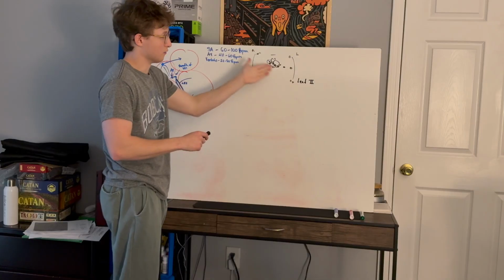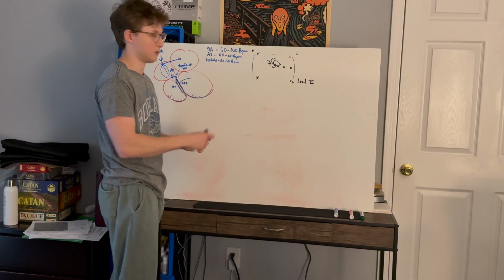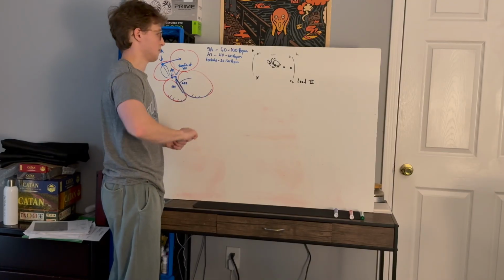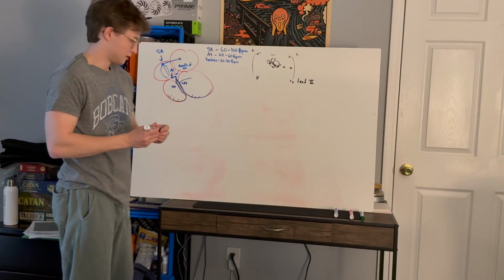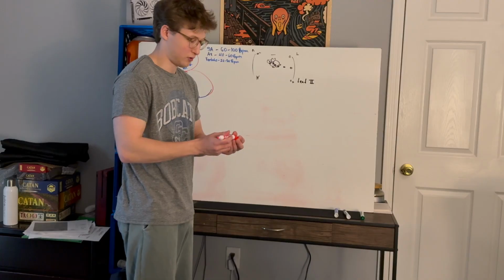So just to give you an idea of what that means when we're talking about lead 2 and its viewing angle of the electrical activity in the heart, let's go through normal sinus rhythm in lead 2.